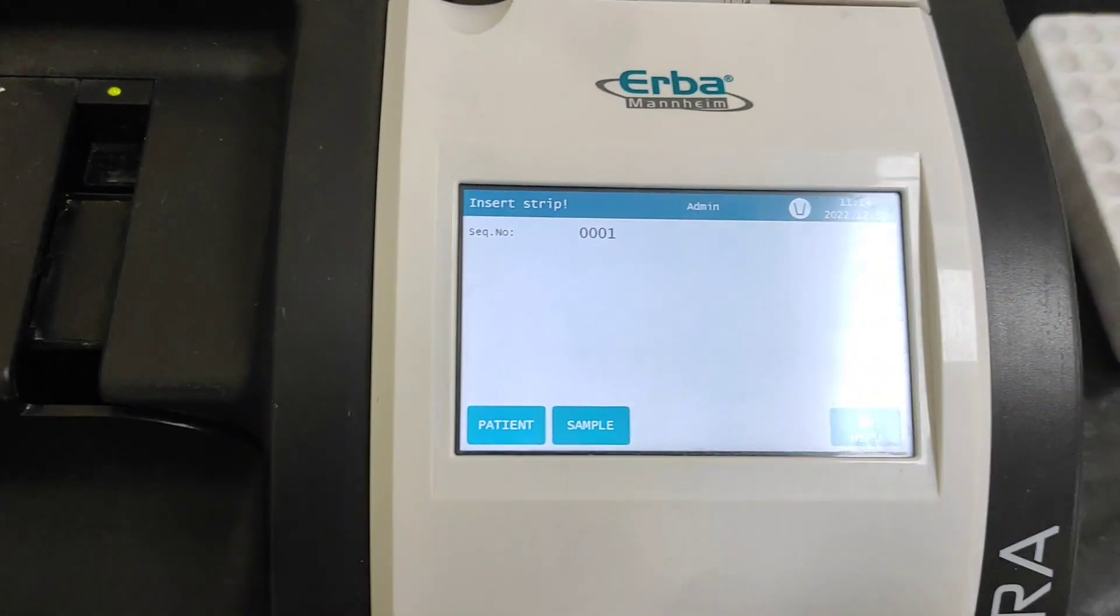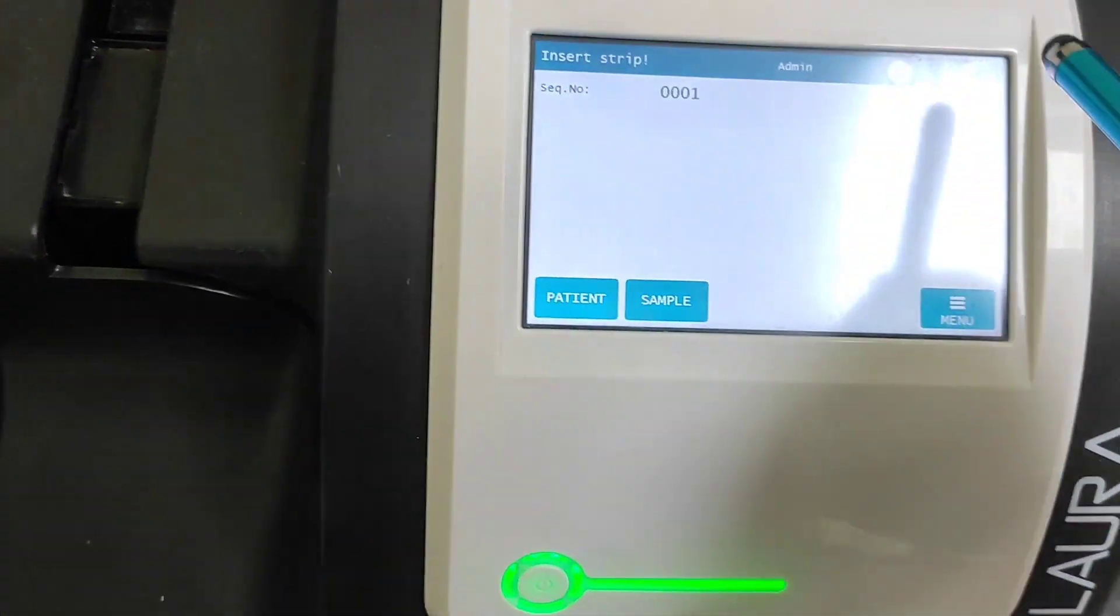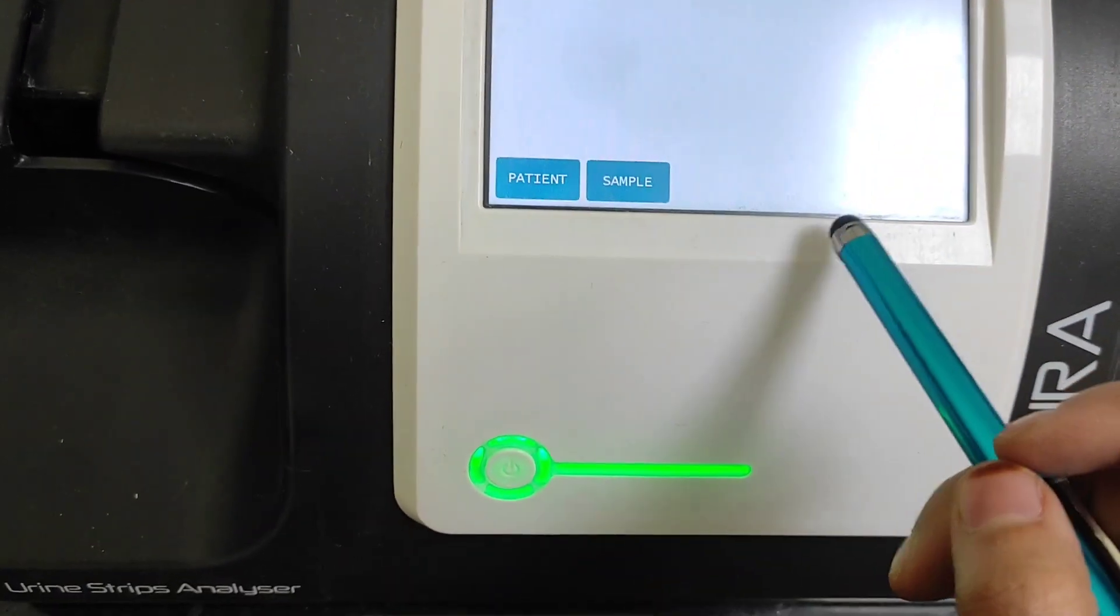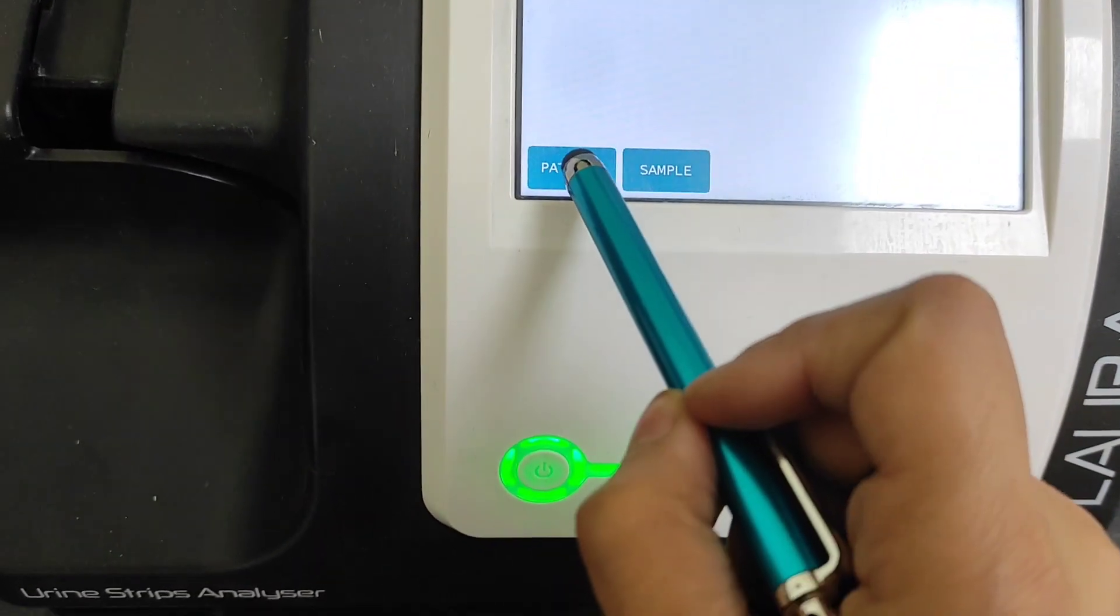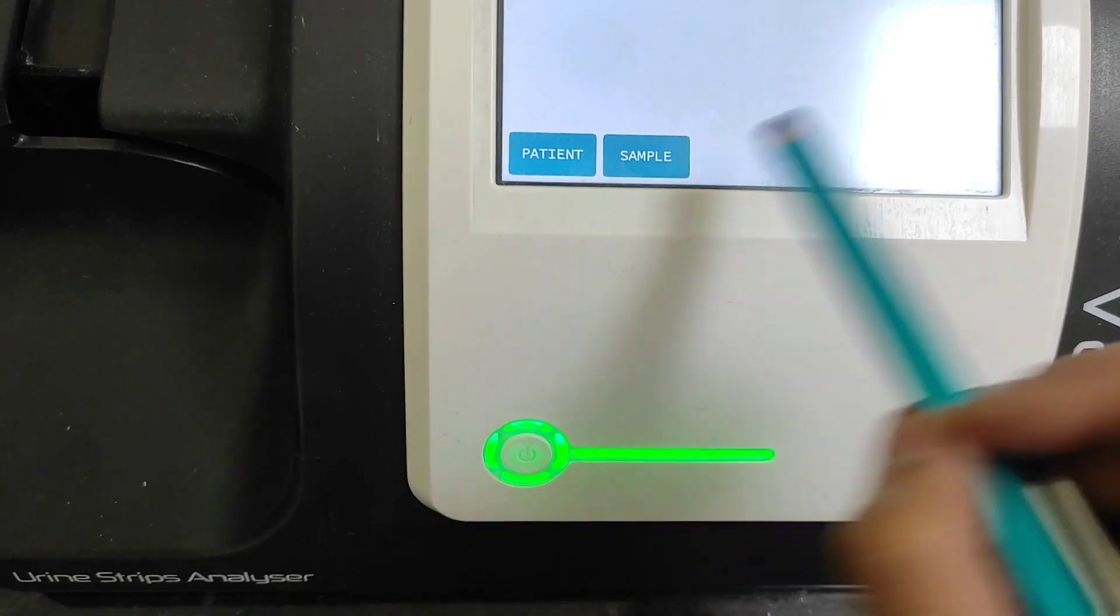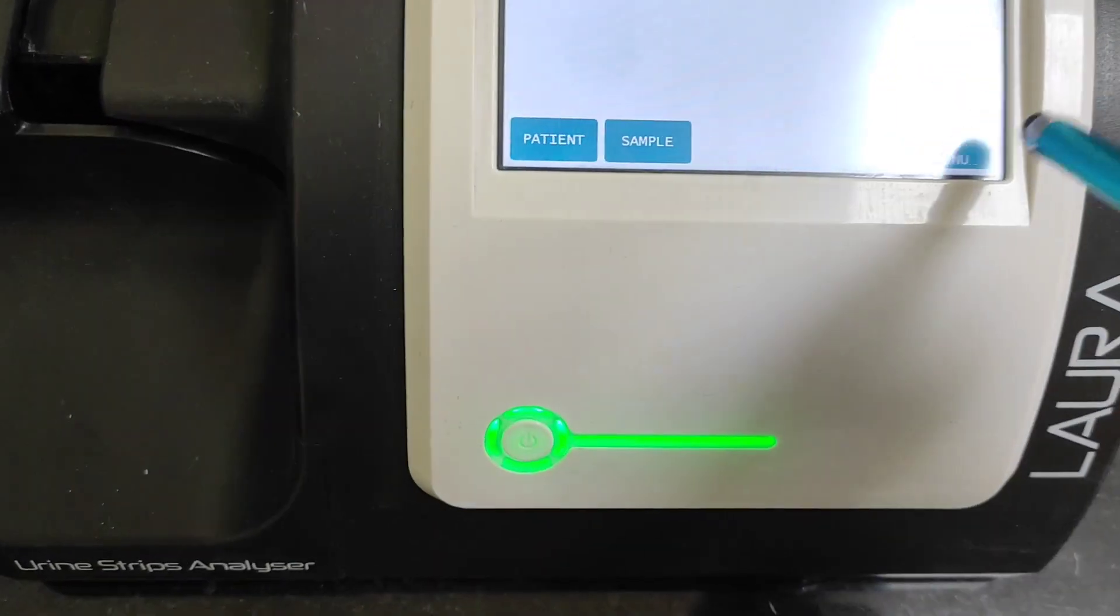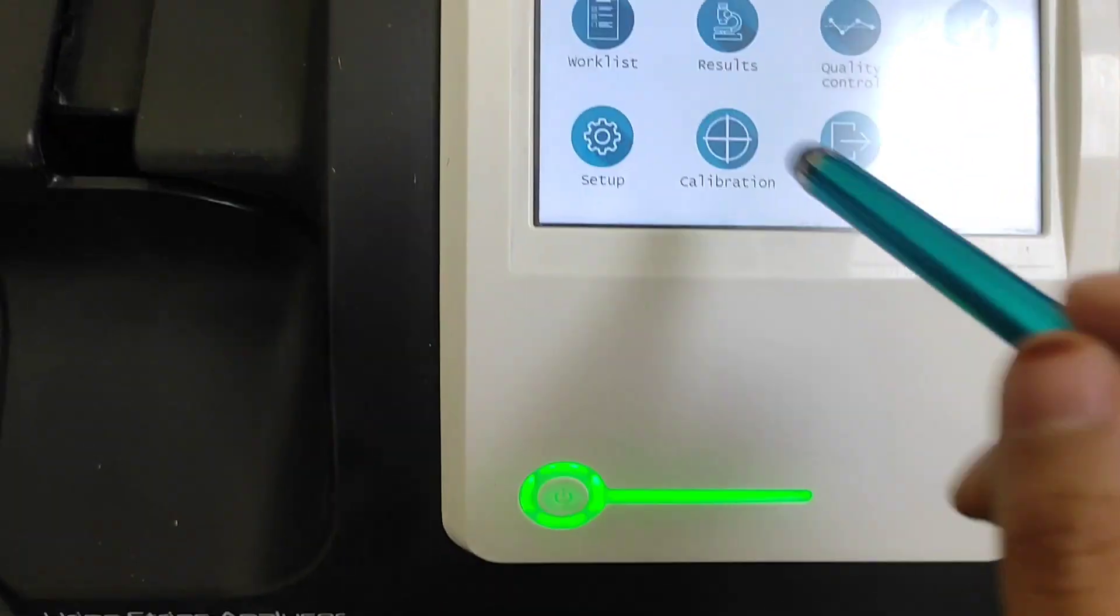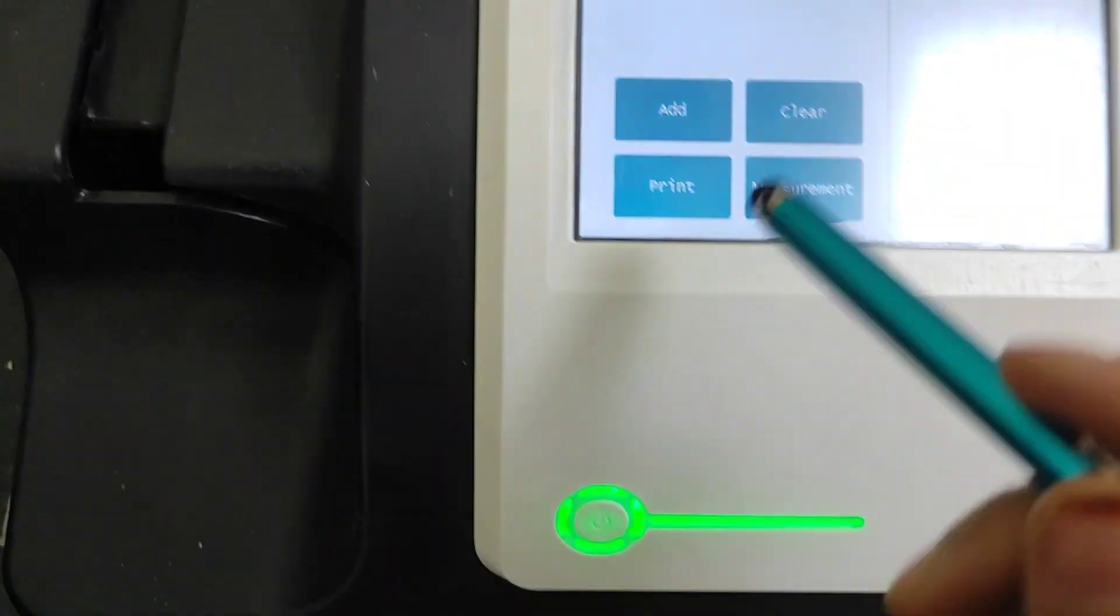This is the main menu of the analyzer. This here is the patient sample option and menu. So let's just go to menu.